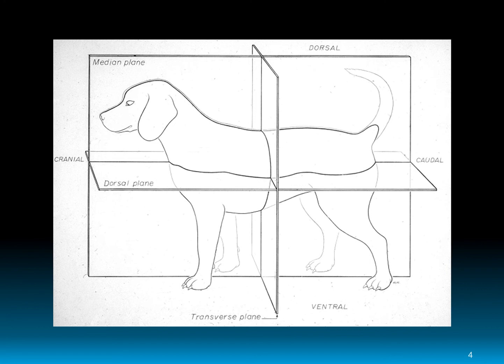There's your simple schematic of a dog sliced into the various parts, your dorsal plane, your sagittal plane, here labeled as a median plane because it's a mid-sagittal plane, and then a transverse plane. And these are going to be the primary planes we're imaging in, although again, not all organs live in perfectly square alignment, and so you will be doing various oblique planes to get the perfect images of some of the organs.